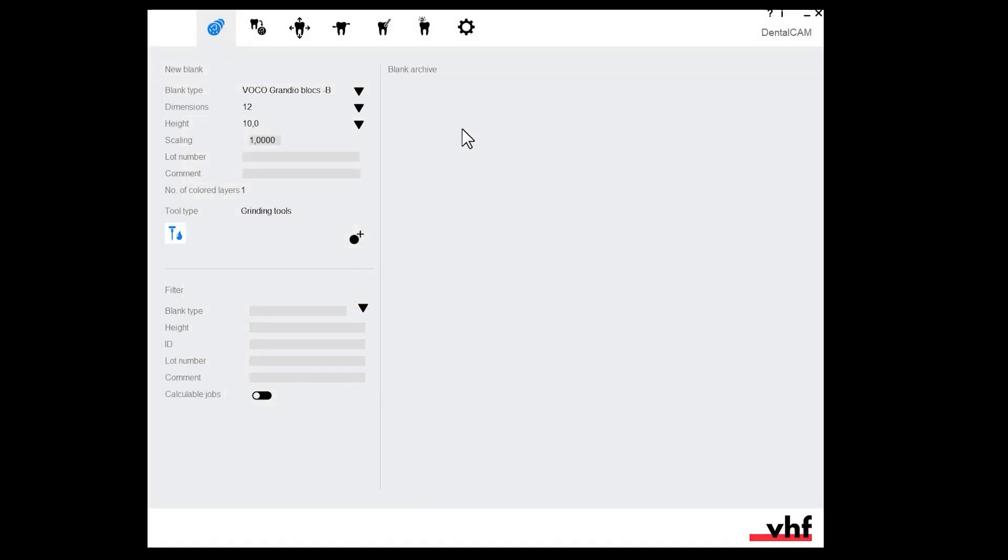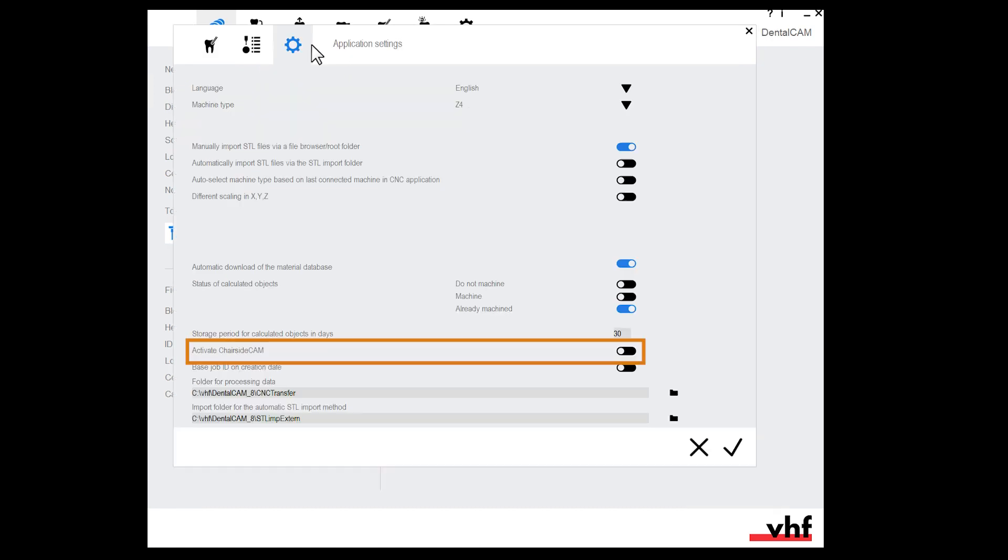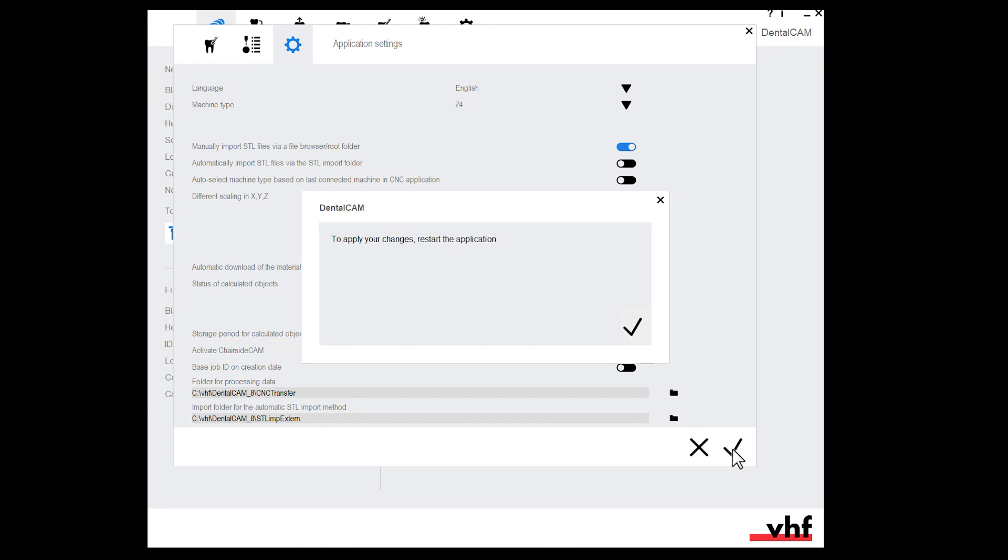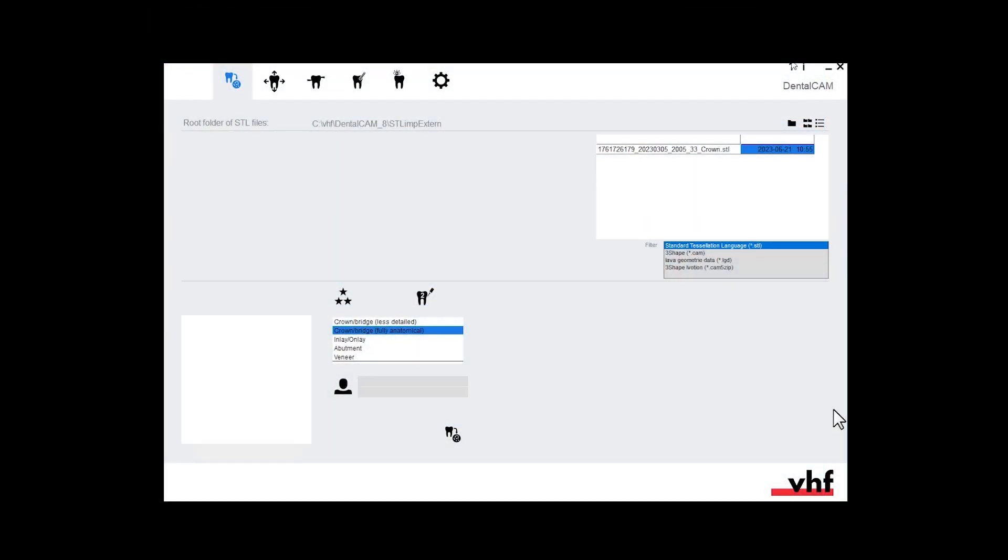Open DENTAL CAM. Open the general application settings. Activate the following option: Activate chairside CAM. Save the changes. Restart DENTALCAM. DENTALCAM starts as chairside CAM.